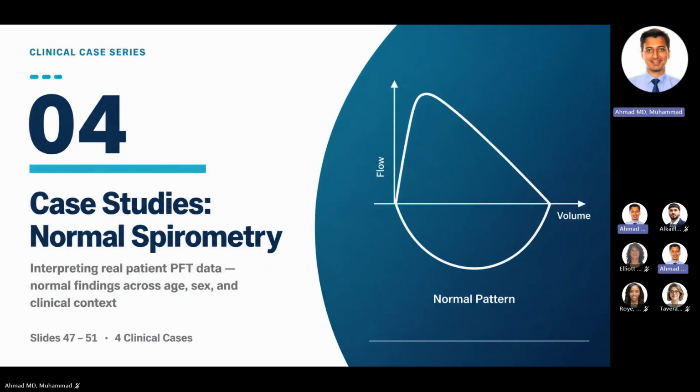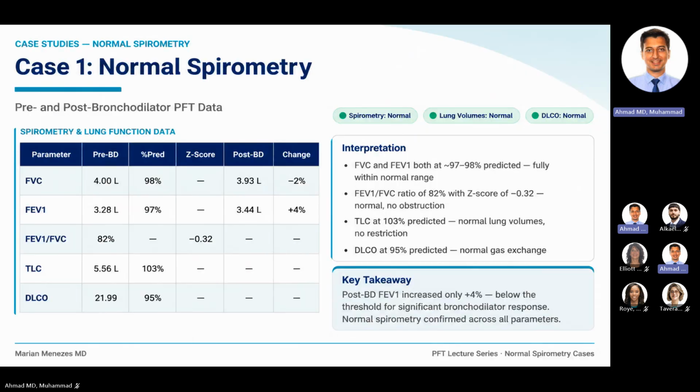From here, I'm going to go over 4 cases of normal spirometry so that y'all can master spirometry as well as lung function. And if time permits, I will go over obstructive and restrictive lung physiology as well.